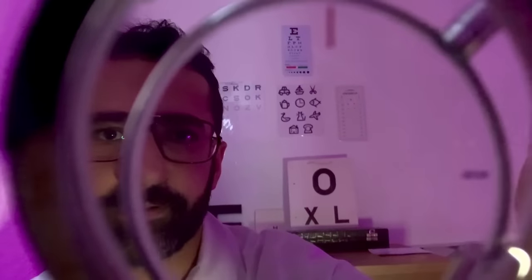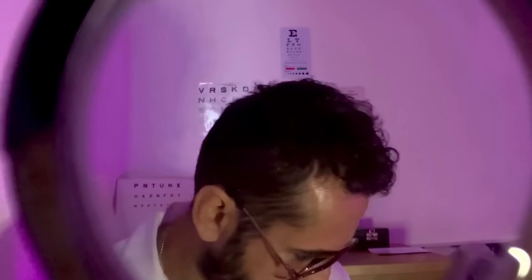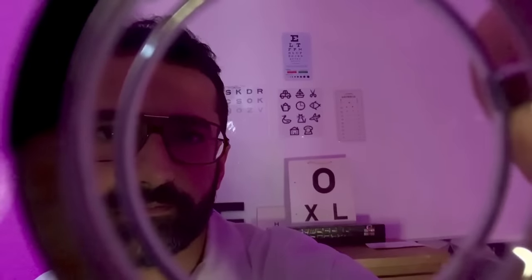Just looking at the round letter again at the top of the lower chart — a little bit more cross cylinder now. Clearer with lens three or four? Three — or four — good. And this time clearer with lens three or four? Three — four — excellent. Looking back at the picture chart, are things clearer with the lens or without? This is with, and this is without. A little bit better with — we can change this lens for you.